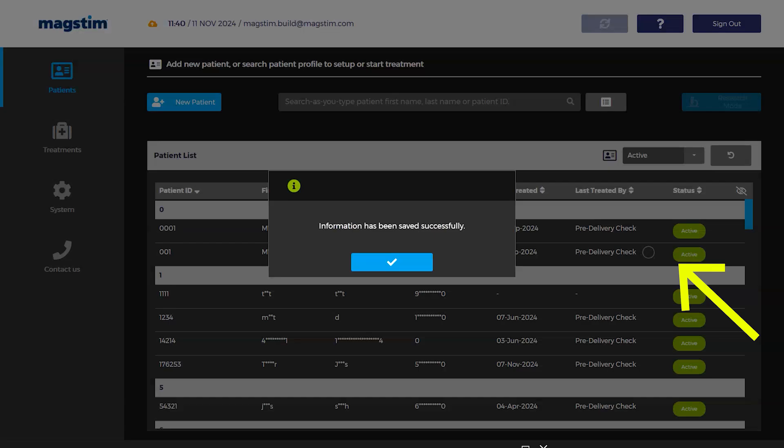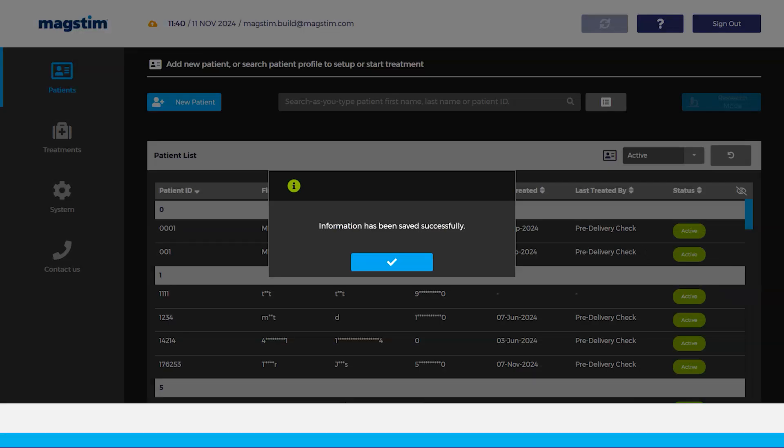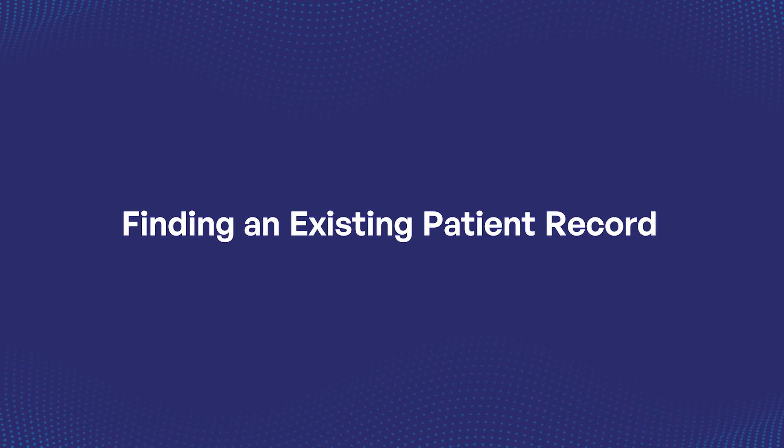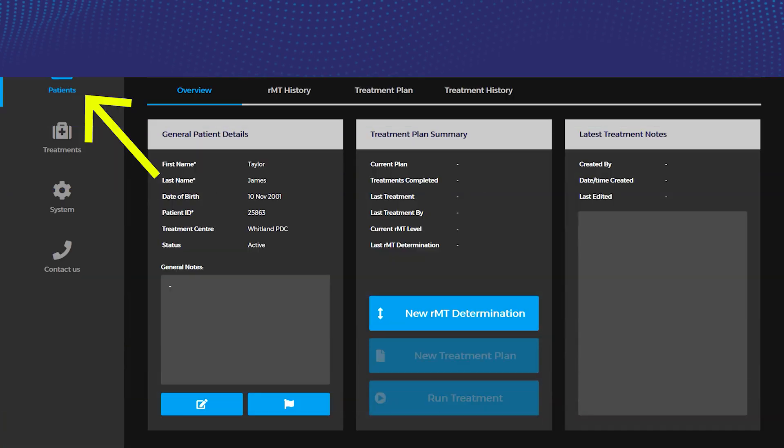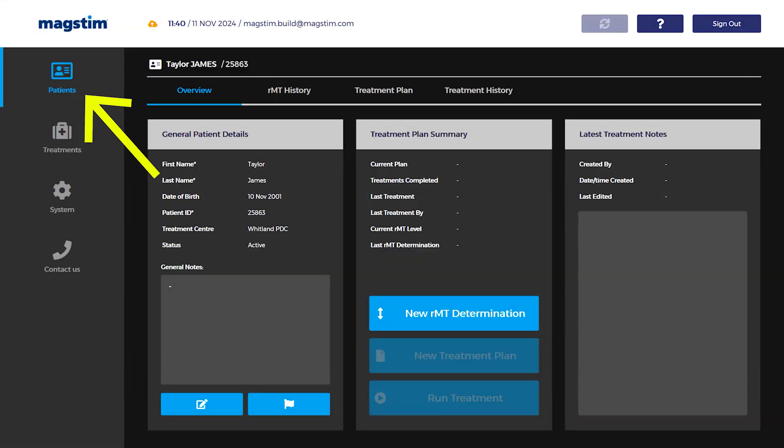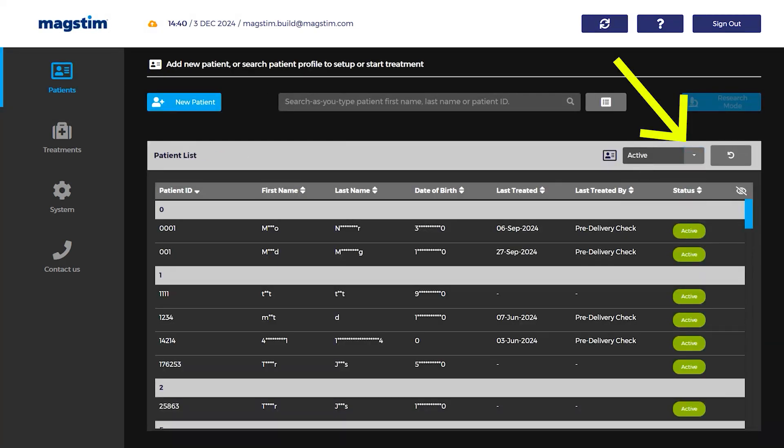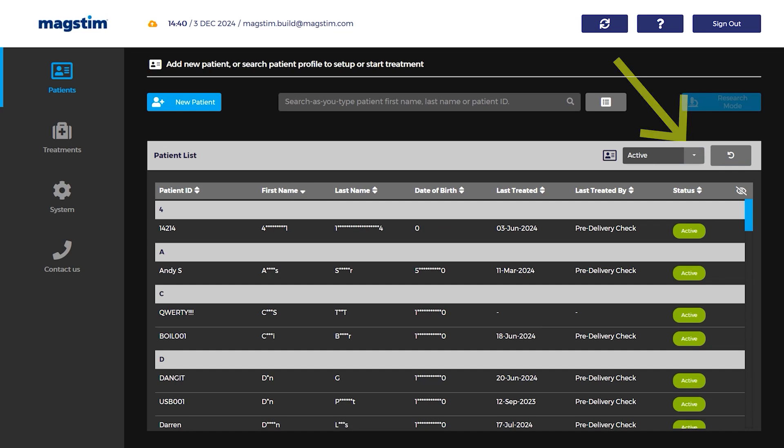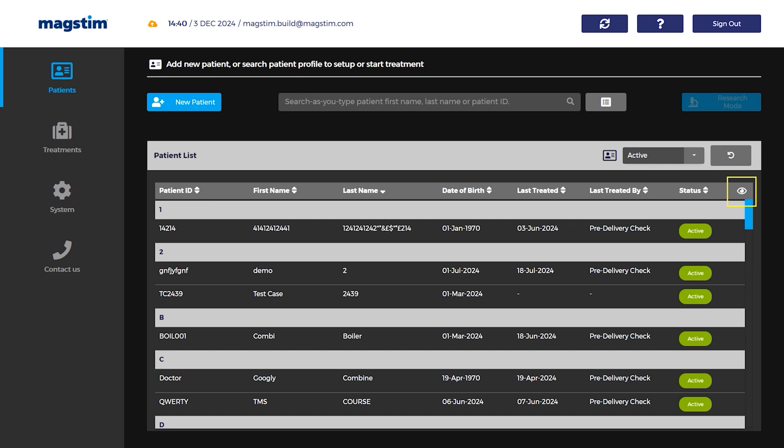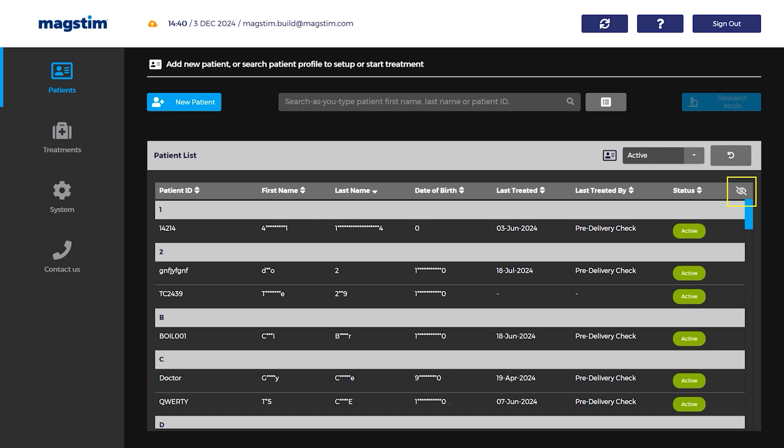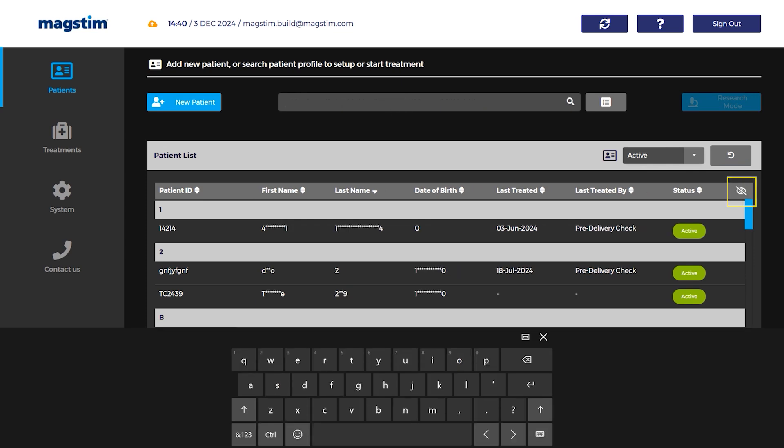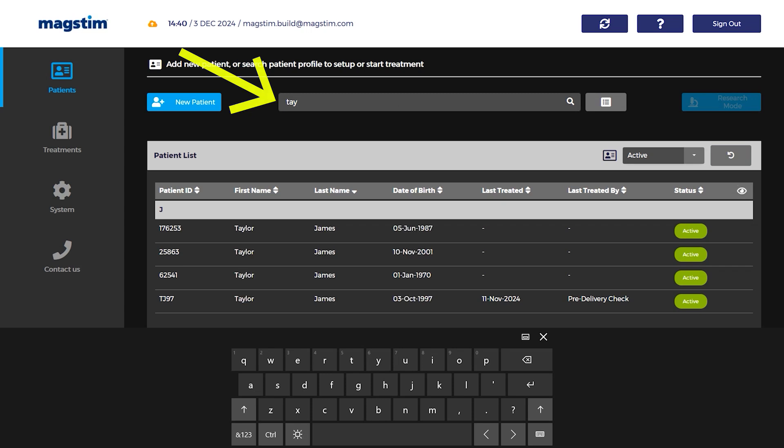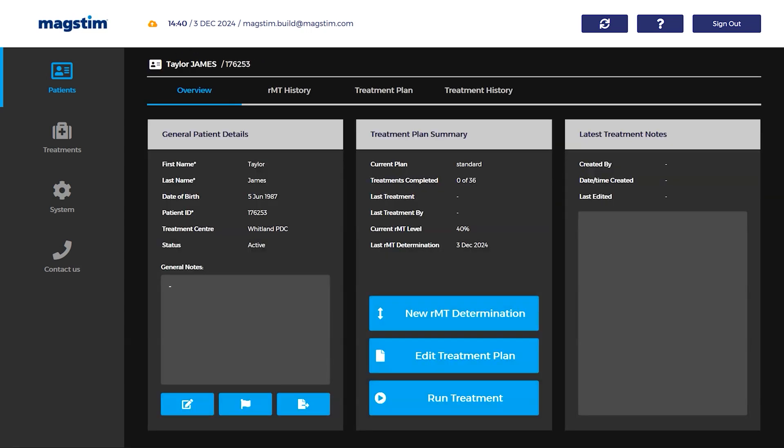Finding an existing patient record: Select the patients tab to display the patient record database. Use the filters to view active, archived, or all patient records. Press a heading to sort the records database according to that column. Choose to show or hide patient details using the hidden content icon. Use the search bar to find a patient record using first name, last name, or patient ID.